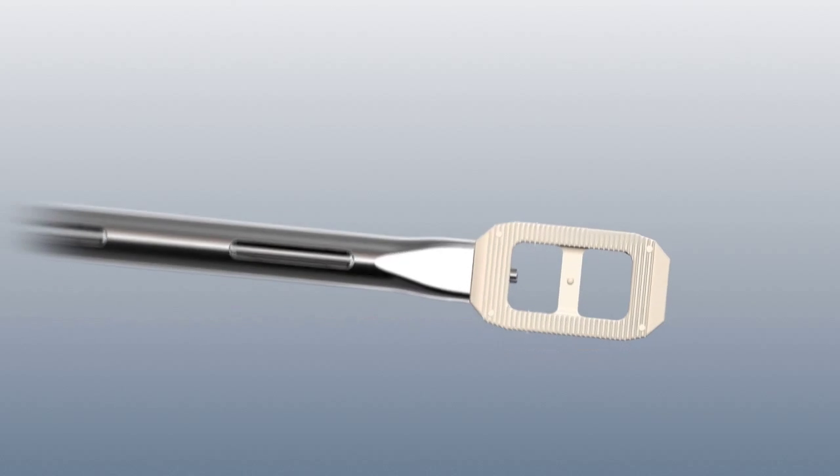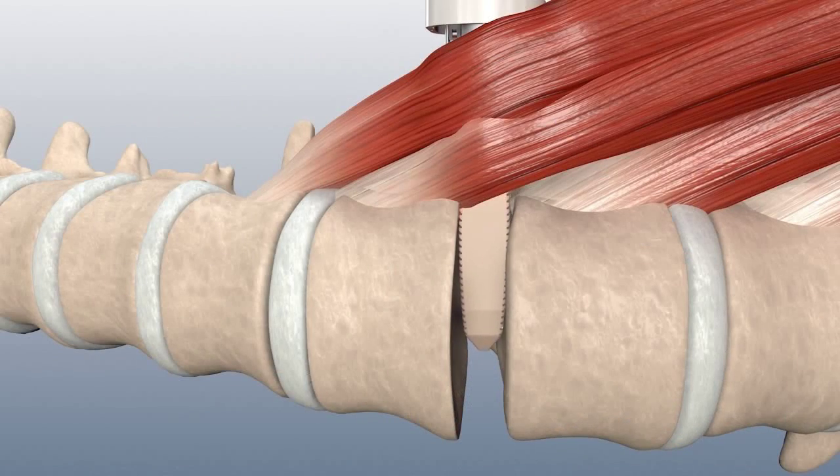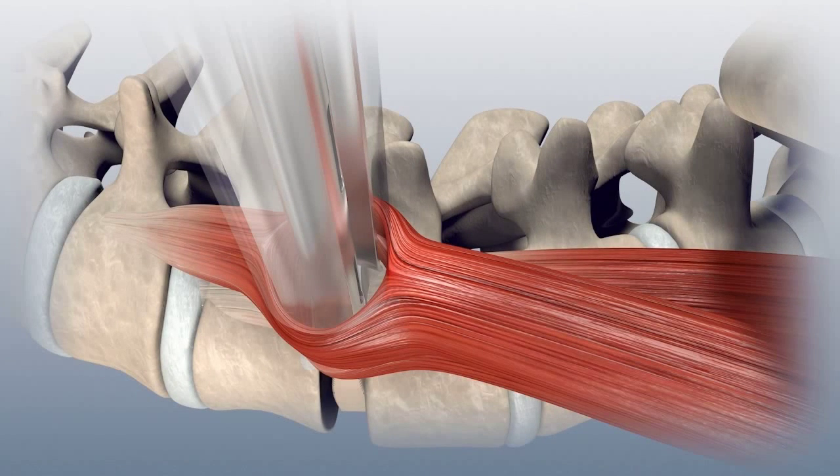Pack the cage with autograft bone for interbody fusion. Utilizing fluoroscopy, insert the cage into the disc space and advance it until the middle marker is centered within the spinous process.